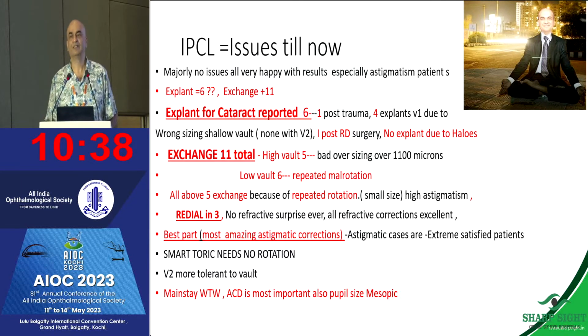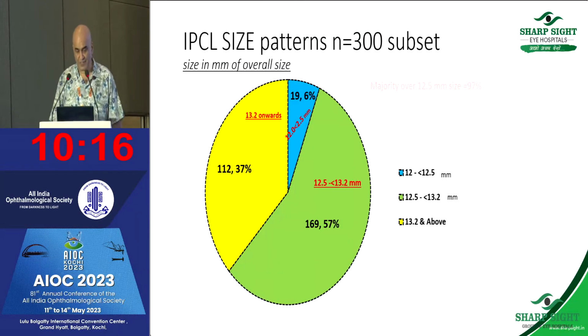Number two, the size of the central hole is huge, so the aqueous flow is not compromised, further reducing the induction of cataract. Re-dialing was done in cases wherever there was an issue with the initial marking, till we got our nomograms right. I've had patients who have developed retinal detachment and had to have silicone oil. Of course, they developed cataracts.